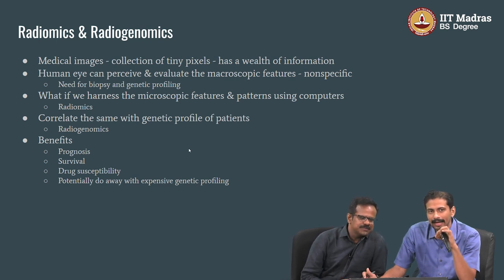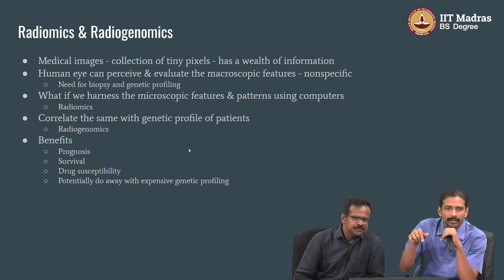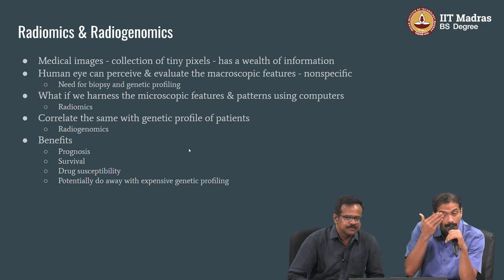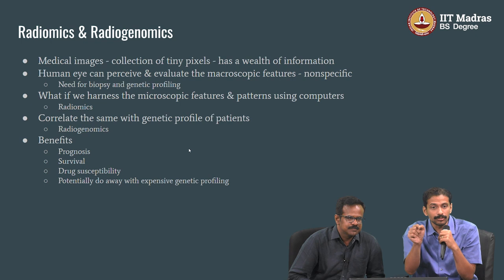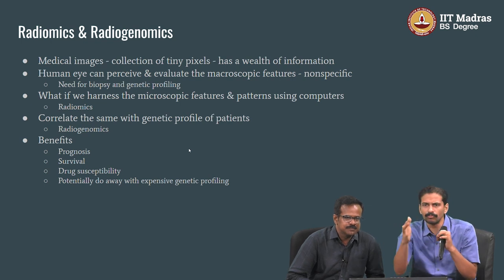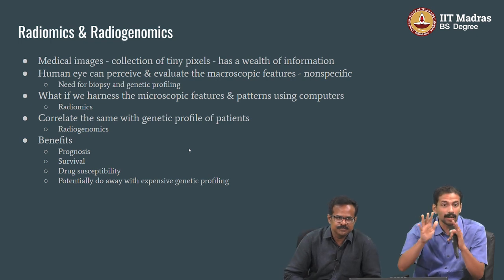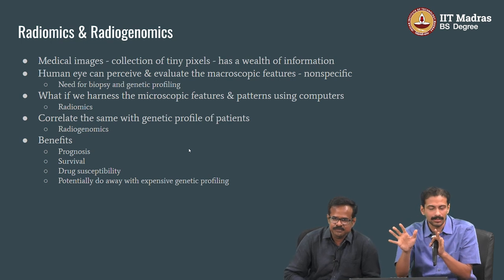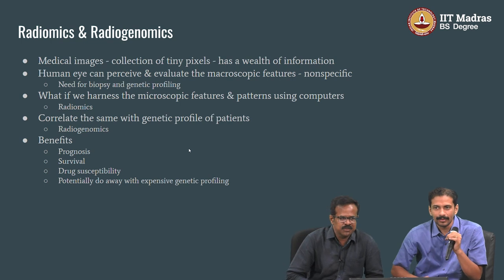Okay. So the other area of interest is images. As I told you, X-ray is a 2K matrix, mammogram is a 4K matrix, CT is a 512 matrix. When you look at a stack of 1000 CT images, you can't look at individual pixels. We just scroll through, and our brain is tuned to pick up a macroscopic pattern. When a pattern matches something, we stop there a little bit and see it carefully. Metaphorically, we see the woods, not the trees.